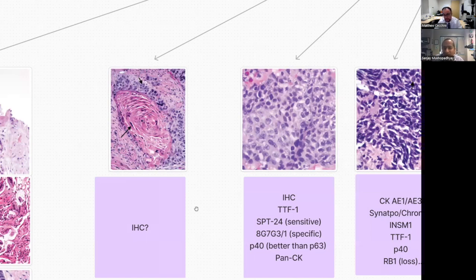Yeah, no, I do the same. I guess there is a risk that it could be a met. But I think this is where it's a collaborative scenario, right? Yes, and I never say a squamous cell carcinoma is a lung primary, because I can never know. It's just a squamous cell carcinoma. Same philosophy as in adenocarcinoma of the lung. The determination of a lung primary is a collaborative clinical pathologic effort.